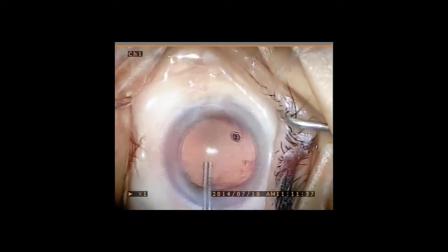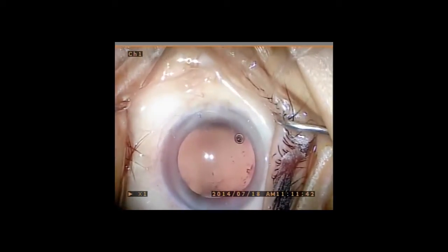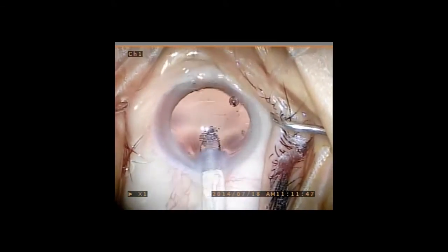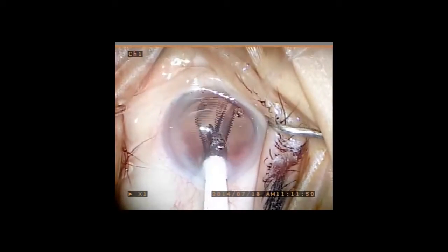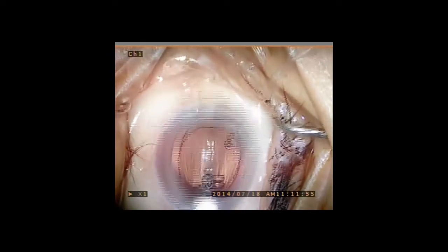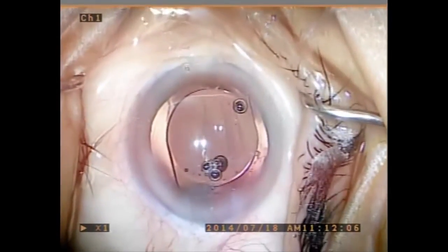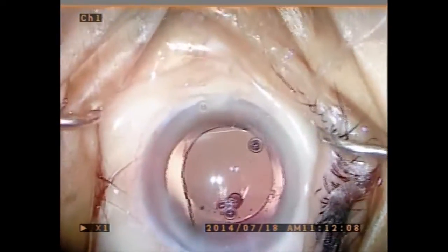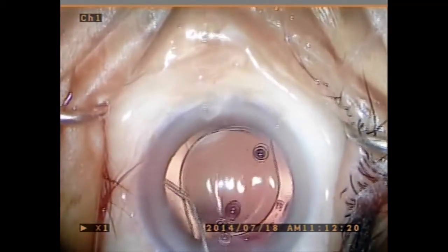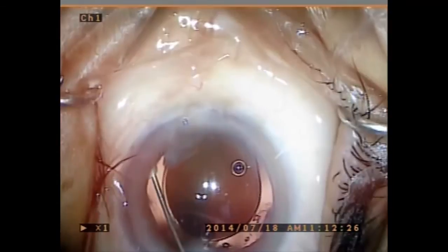A LensTech HD monofocal lens is then delivered into the capsular bag in a controlled fashion. Then a Rycroft 30-gauge cannula is passed under the iris and over the peripheral anterior capsule in the area of the zonular dehiscence in order to deliver 0.2 cc's of Trimoxy Vanco into the anterior vitreous.